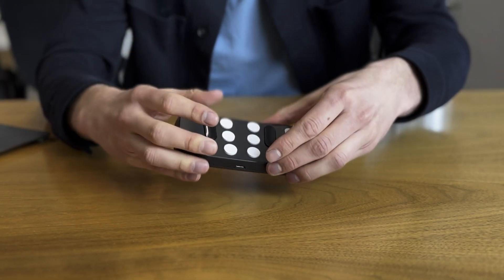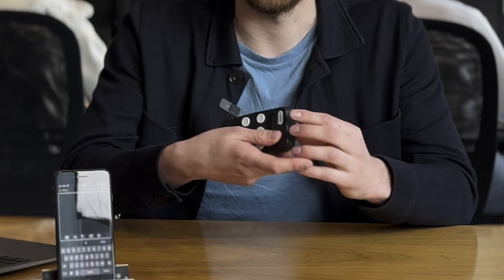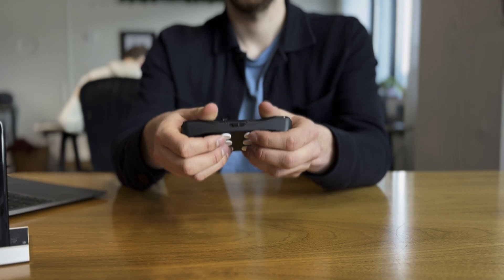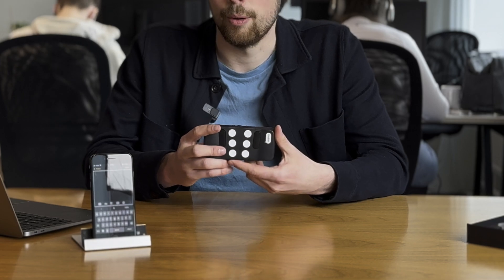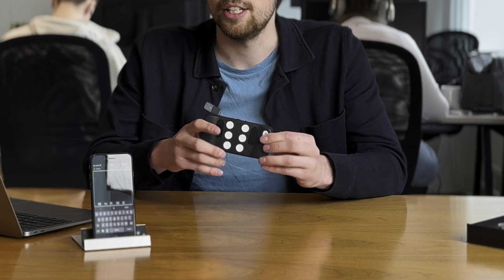The next step is to hold your Hable One correctly. The Hable One is completely different than any other keyboard you might be used to — we don't put this on a desk or surface. Instead, we hold the Hable One in the air with two hands. Turn it sideways, 90 degrees, so it's in a horizontal mode. There's one side where you feel eight buttons — those buttons should face away from you, so the flat side faces towards you. When holding it correctly, the on and off switch on top is pointing at the ceiling.